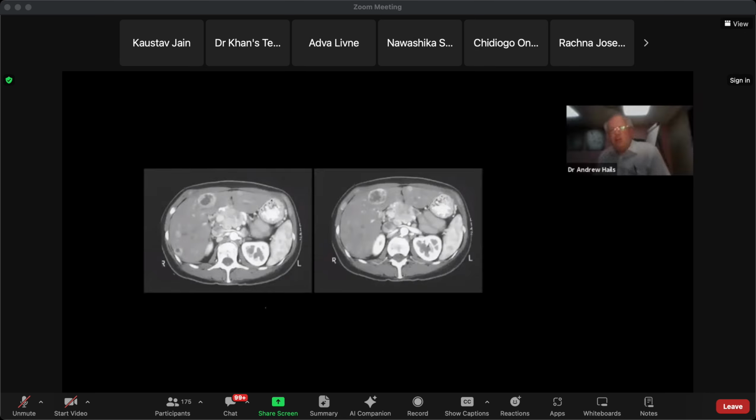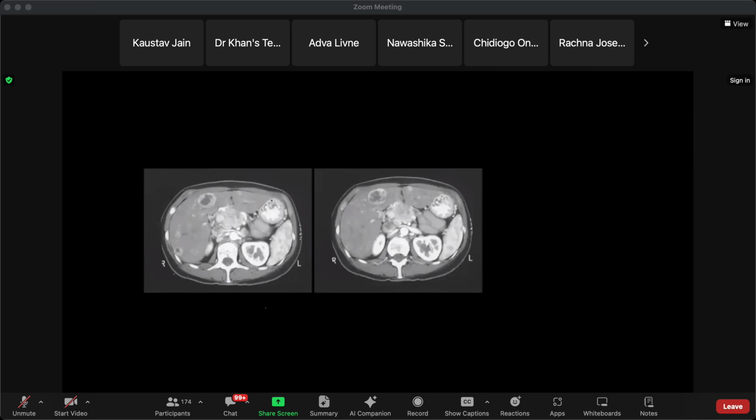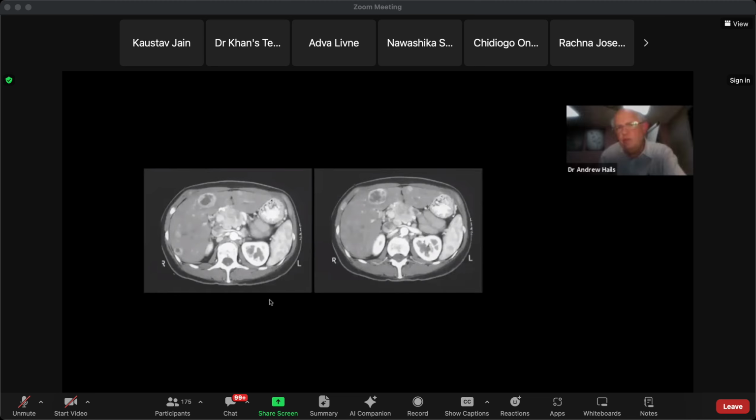All right, I didn't really show you this very long. Just look at this. Does that fit with what you were saying? So the liver metastases, yes, and there is a soft tissue mass just at the portal confluence, again in the mesenteric region, not really in the mesentery actually, but there is a soft tissue region in the central abdomen. Yeah, all of that soft tissue there.